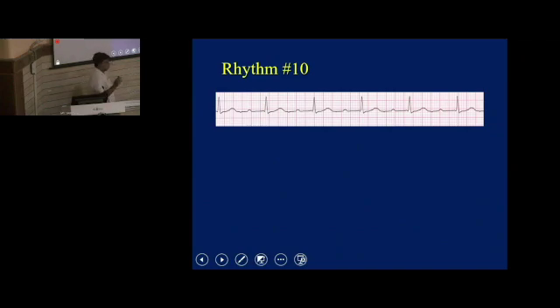Whenever you try to analyze an ECG, go stepwise. Rate, rhythm, then P wave, QRS, T wave, then PR interval, then QT interval, and ST segment and all. Okay? So don't jump, don't try to recognize something abnormal immediately. Just go through these steps. First see the rate of the ECG, then the rhythm of the ECG. Is it a regular or irregular rhythm? Is it generated from the SA node? Is it sinus rhythm or not? Is it an ectopic rhythm?